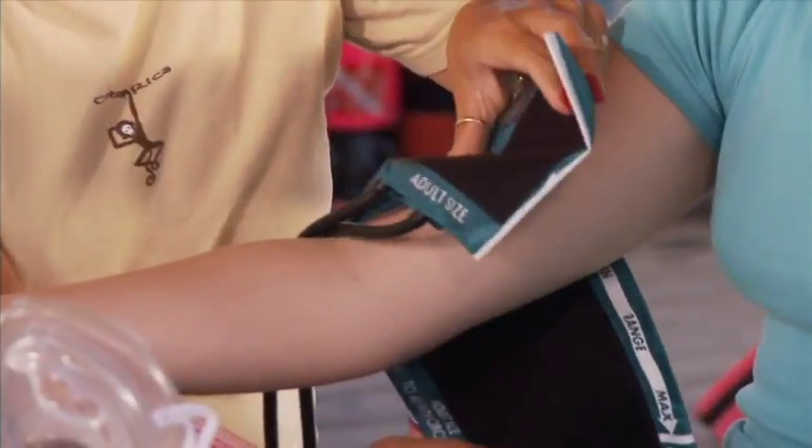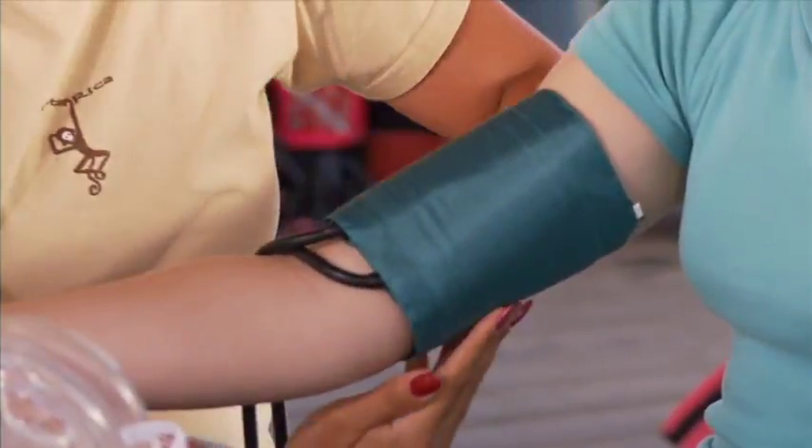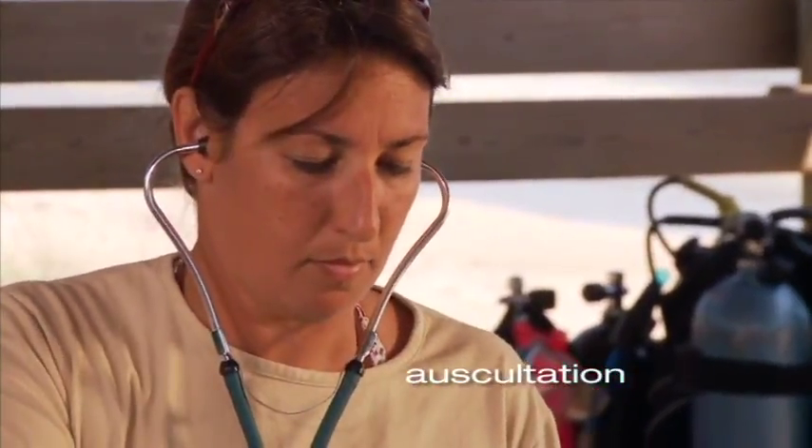There are two methods to determine blood pressure. You will need a blood pressure cuff for both. The first technique is called auscultation — that means you'll be listening to the pressure through a stethoscope.